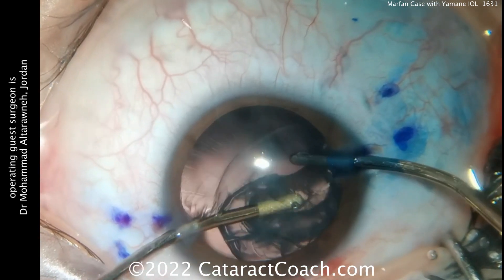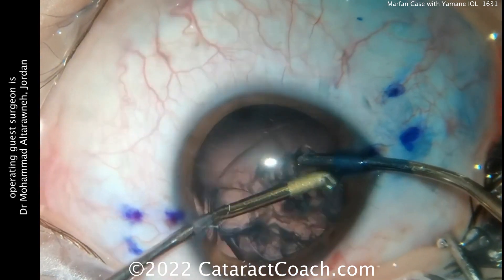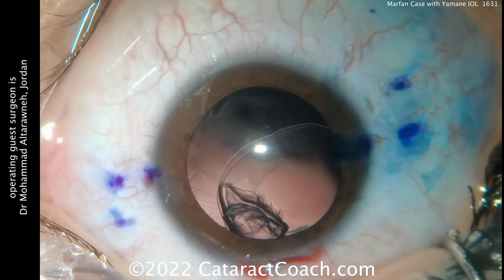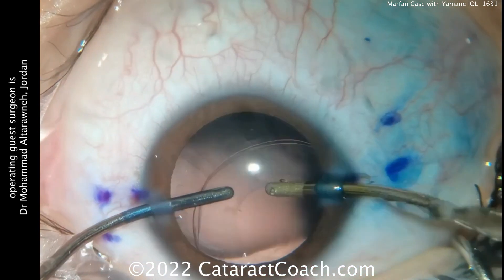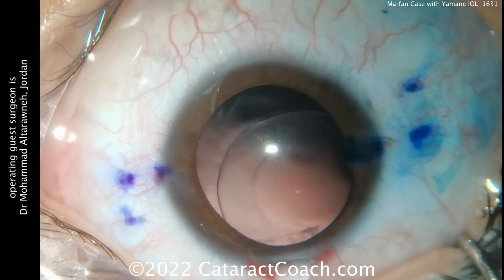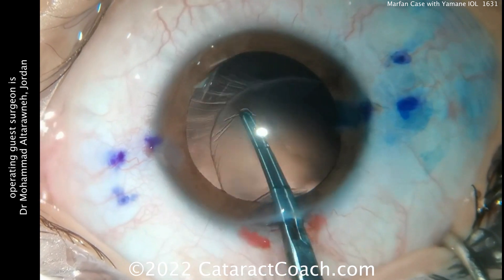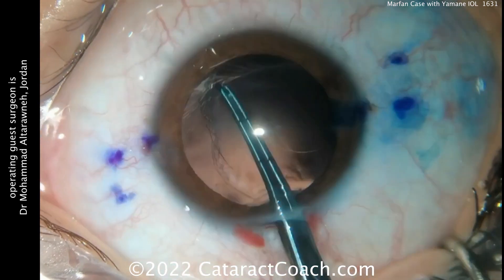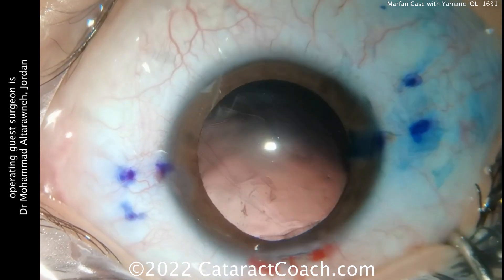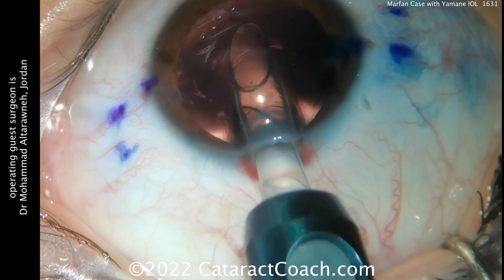Because the patient is on the young side, the vitreous is more solid, and the patient has an anterior hyaloid face that's intact. So you can remove this nucleus — the whole lens, even remove that capsule — and put a Yamane lens in while keeping the anterior hyaloid face intact. There's grabbing the capsule; you can see there's really not much support. The entire capsule can just be brought outside the eye. It's gone. So now the eye is totally aphakic, no capsule support at all.